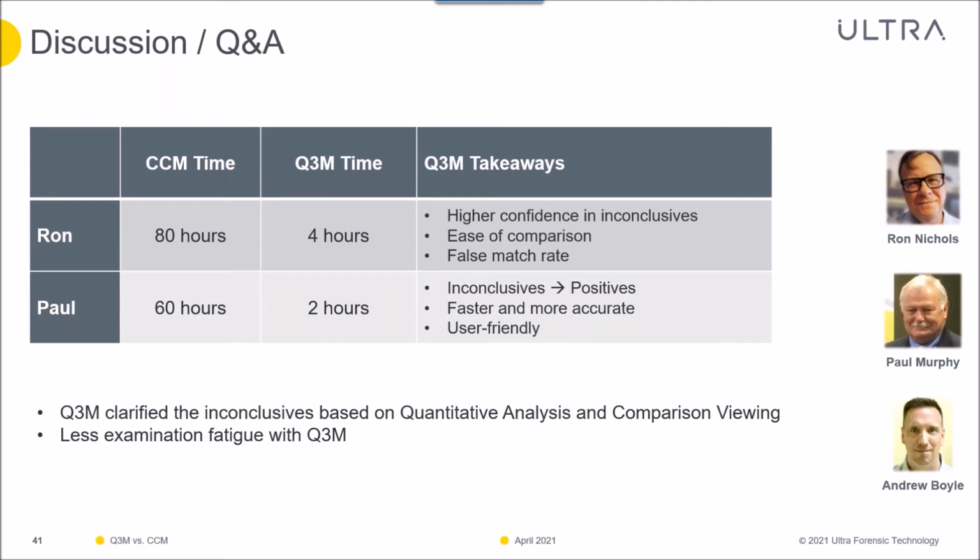Okay. All right, and that felt like a natural workflow for you as far as just your approach. It was intuitive to go that route, I suppose. Yes, that was, as I say, I did not obviously have the luxury of a quantitative analysis as well as superior images on a conventional microscope. It is a very old microscope that I was using with very limited illumination.